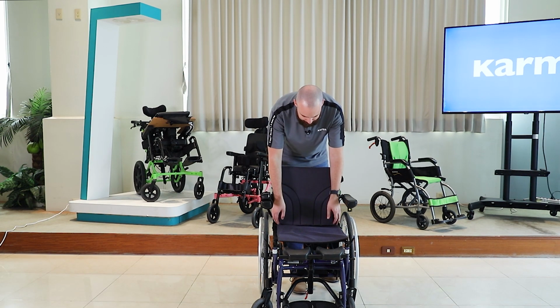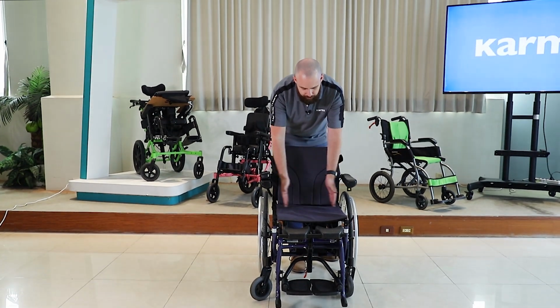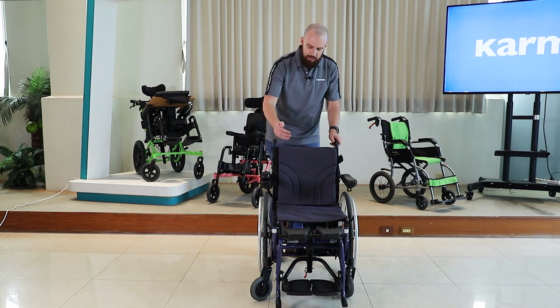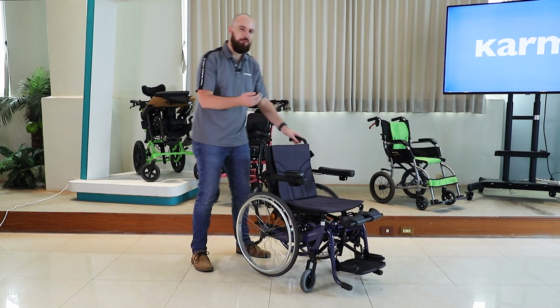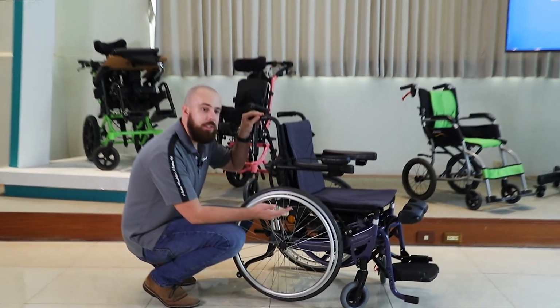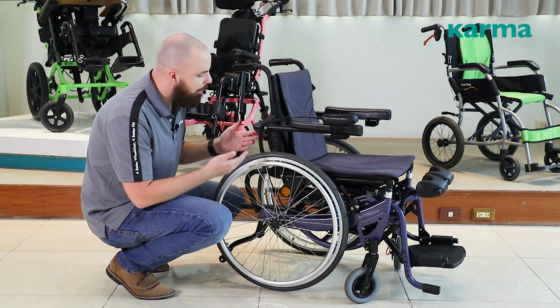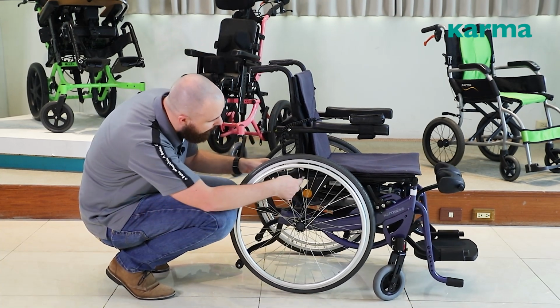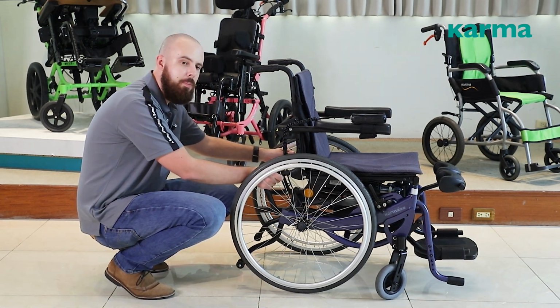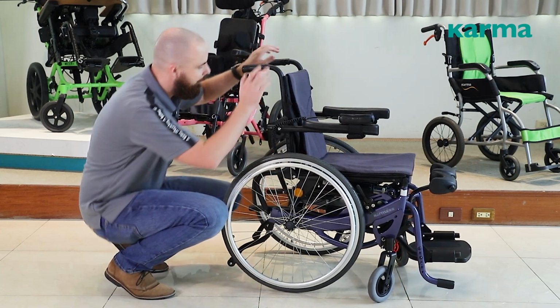So let's first talk about the seat. For the seat width, we have three options. There's 40, 44, and 48 centimeters. It's about 16, 17, and 19 inches. And then for the seat depth, it's the same, 40, 44, 48 centimeters, 16, 17, 19 inches. But the difference being the depth is adjustable. Now, for the seat width, once you choose the width, that's the width you have. But for the depth, if you want to change that, all you need to do is loosen the bolts here and here, and then you can slide the inner frame tube back out of the seat to increase the depth or push it in to decrease it. Okay.